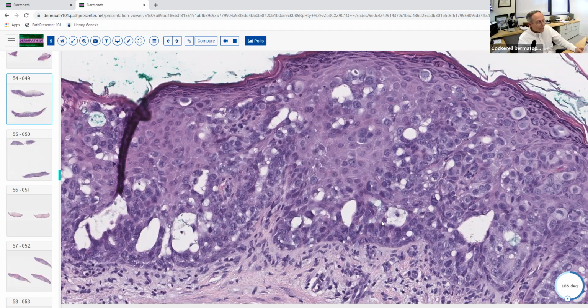Metastatic adenocarcinoma of the bladder, well, that clearly wouldn't look like this if it occurred on the chest. Now, that wouldn't really be the fairest answer if this was in the groin area, because you could say, well, it kind of is a metastasis in a way. It's spreading locally. So I don't think they would ask you that if it was in that location, but this wouldn't occur on the chest. Metastatic bladder cancer spreading to the chest would be a nodular lesion in the dermis. It wouldn't look like this.